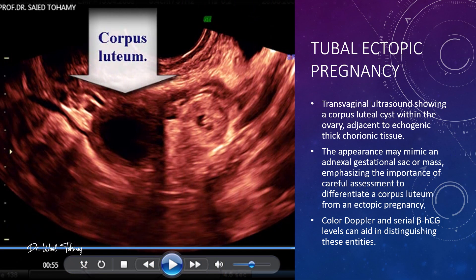Take a look at this transvaginal ultrasound. Here we see a corpus luteum cyst within the ovary right next to echogenic thick chorionic tissue. At first glance, this can mimic an adnexal gestational sac or mass, which is why careful assessment is key. Look at the wall and the internal echoes — a corpus luteum often has a thicker wall and less defined internal content compared to an ectopic sac. Color Doppler and serial beta-HCG levels are your friends here, helping you tell the difference between a benign ovarian finding and a true ectopic pregnancy.